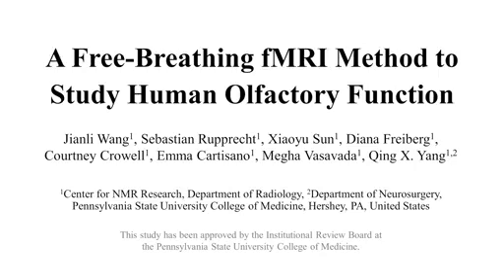The overall goal of this video is to present and explain an efficient and easily adaptable method of fMRI in order to effectively explore the mapping of the human olfactory system without interference of natural breathing.